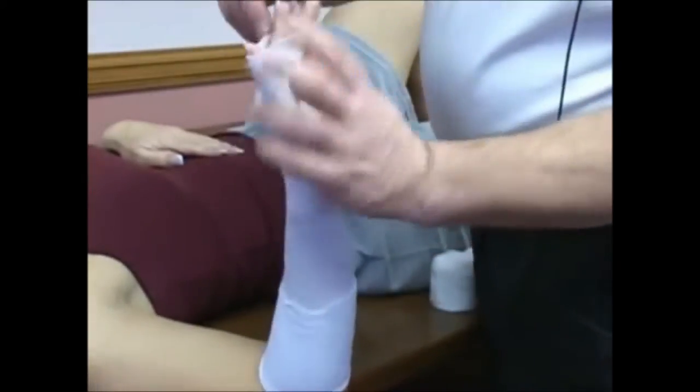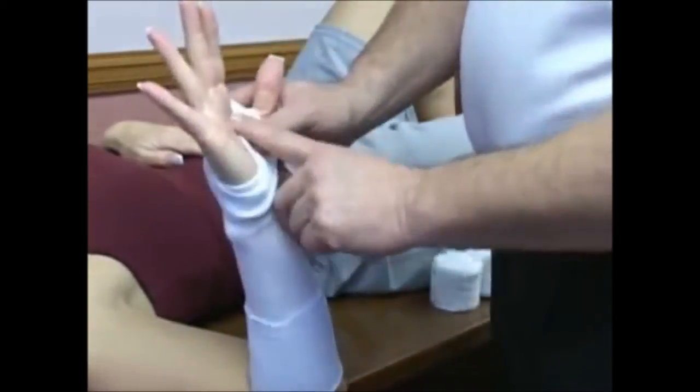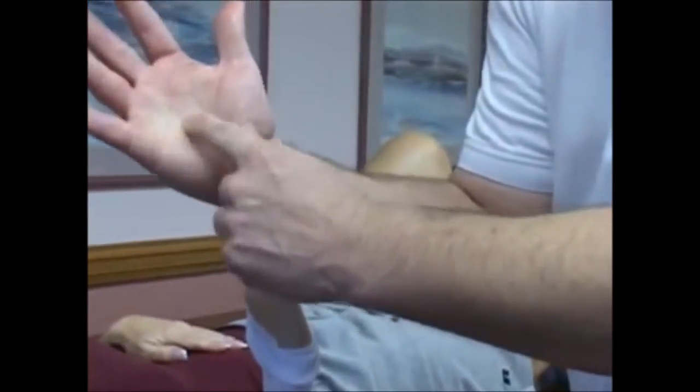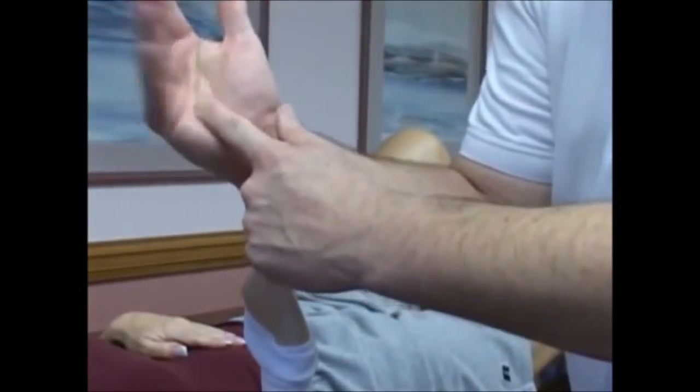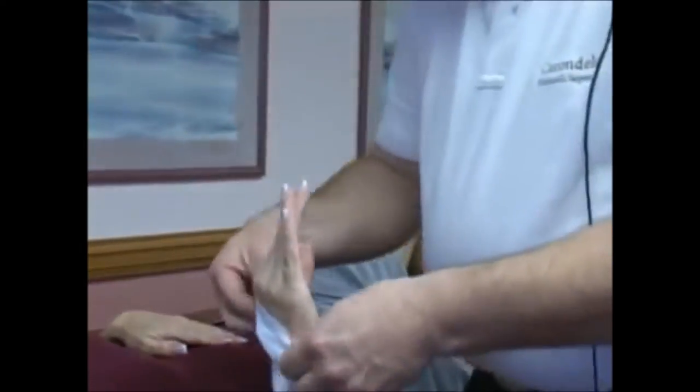Now I'm looking at the hand — there are creases in the hand that tell you where the hand folds. Here's the crease I'm looking at right here. If you put a cast up to here, you won't be able to fold your hand. If you put a cast down to this crease, you'll be able to fold your hand and move your fingers all the way.